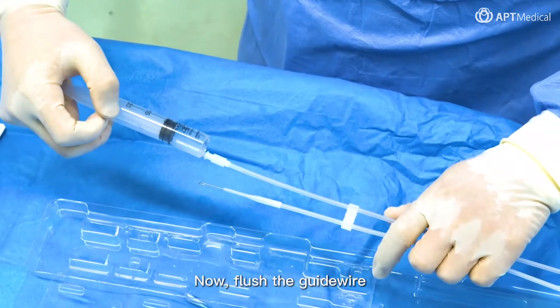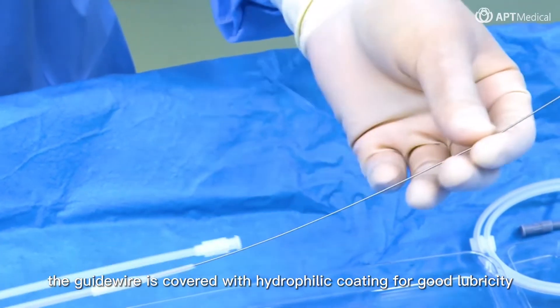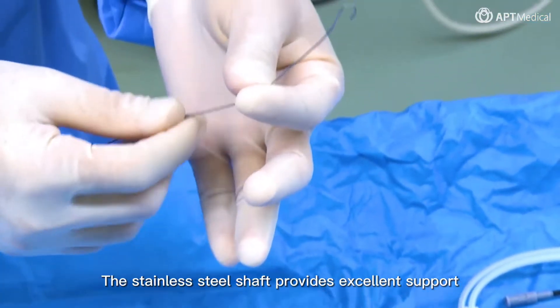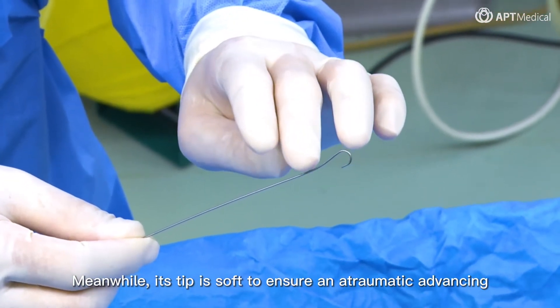Now flush the guide wire. The guide wire is covered with hydrophilic coating for good lubricity. The stainless steel shaft provides excellent support, and its tip is soft to ensure atraumatic advancing.